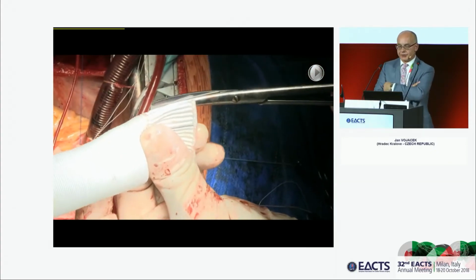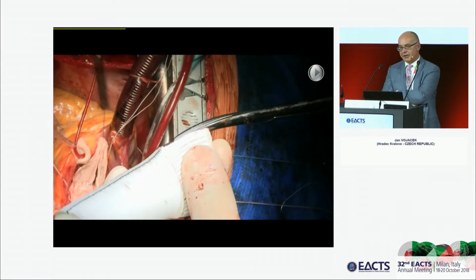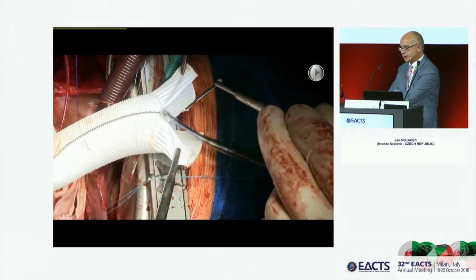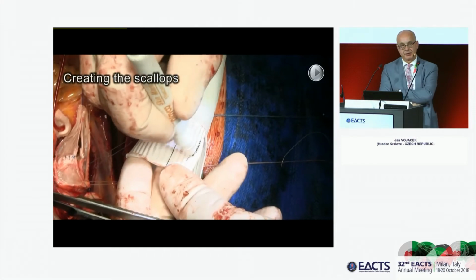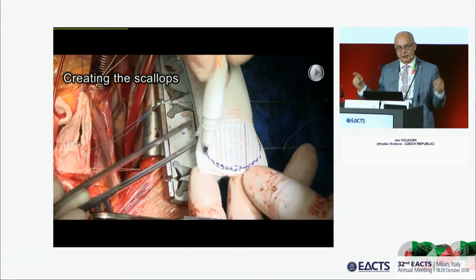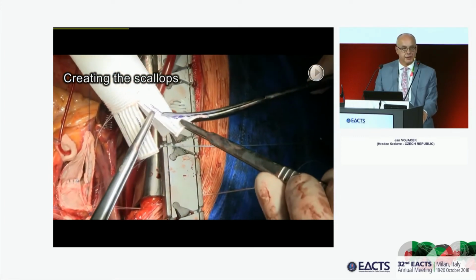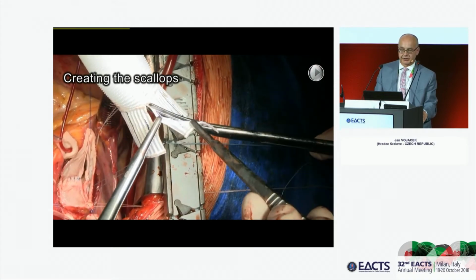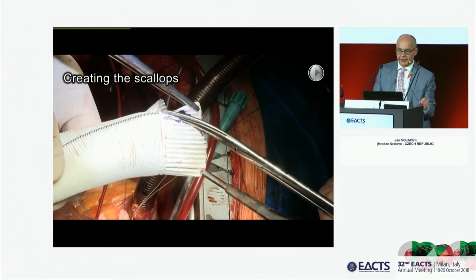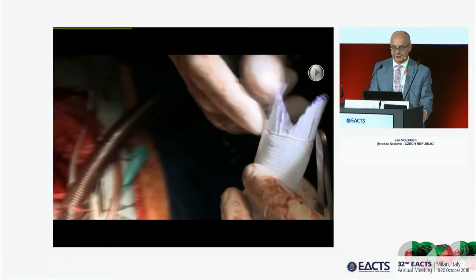For this we use this Valsalva prosthesis, and this is important in case of bicuspid aortic valve. We created just two tongues, 2 neosinuses. Why? Because we know that in case of bicuspid aortic valve, the optimal configuration is like in pure bicuspid aortic valve, with the commissures facing each other at 180 degrees. So that's why we create these 2 identical tongues, identical neosinuses.